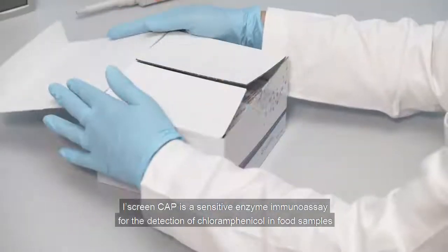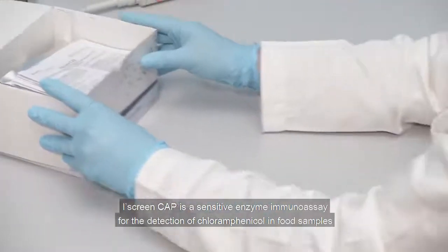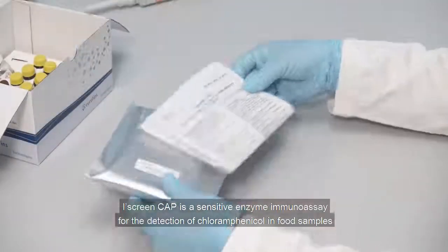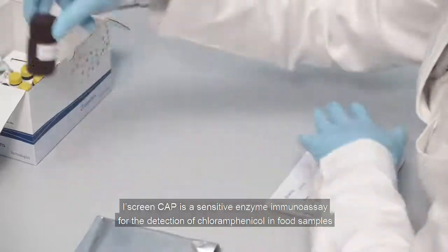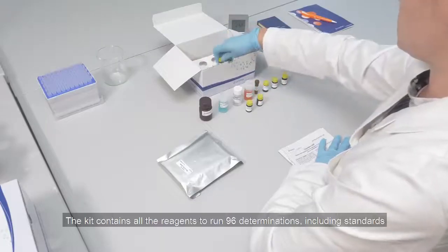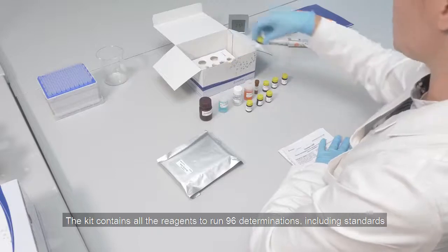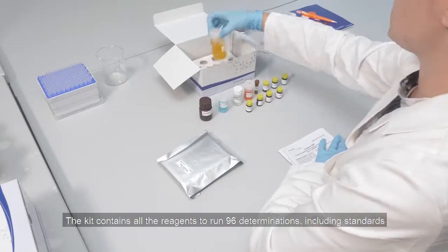I-screen CAP is a sensitive enzyme immunoassay for the detection of chloramphenicol in food samples. The kit contains all the reagents to run 96 determinations, including standards.